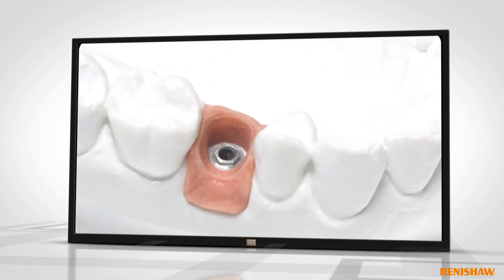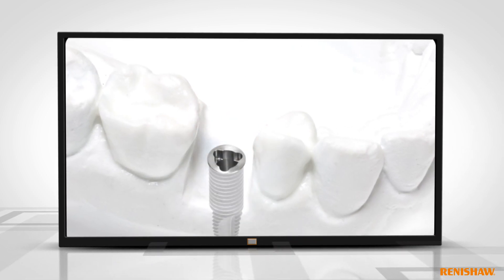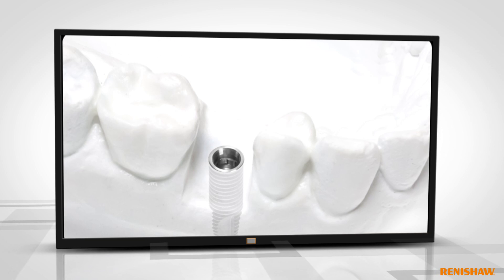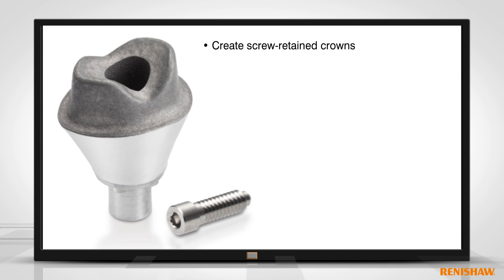Renishaw laser abutments are compatible with most common implant types. Both screw retained crowns and custom abutments can be created using the latest 3D printing technology.